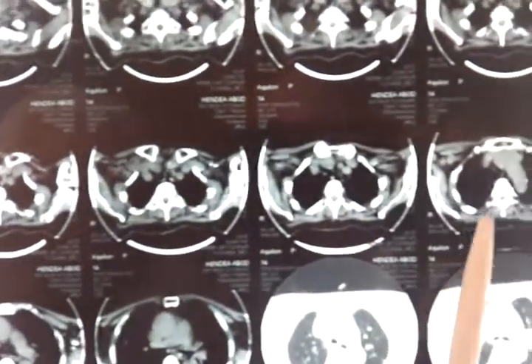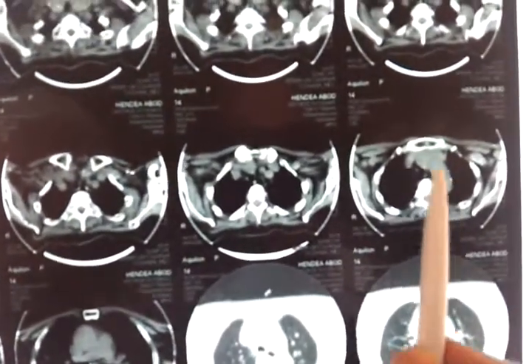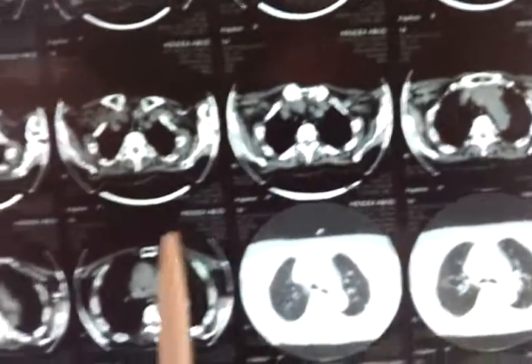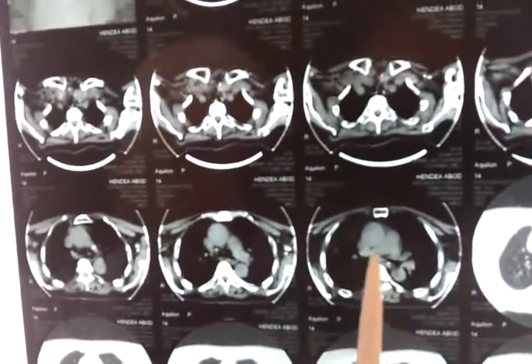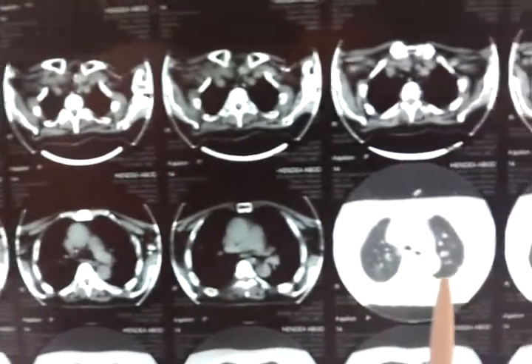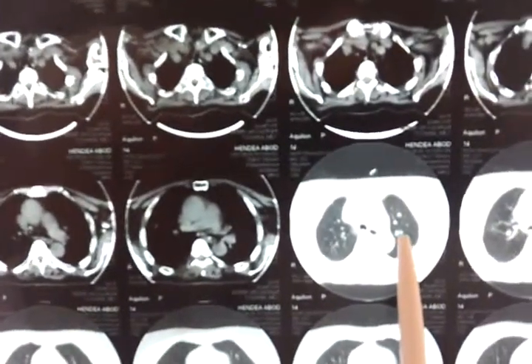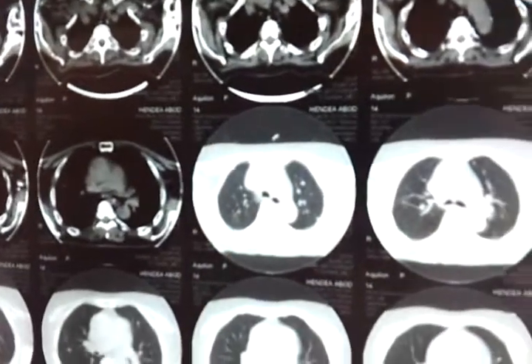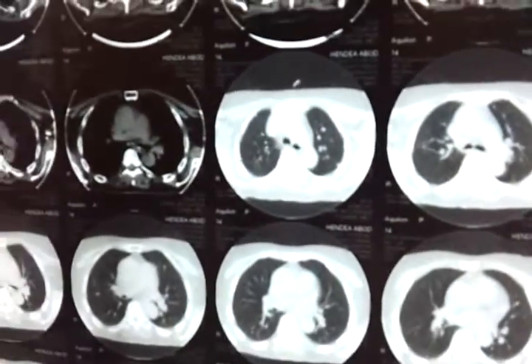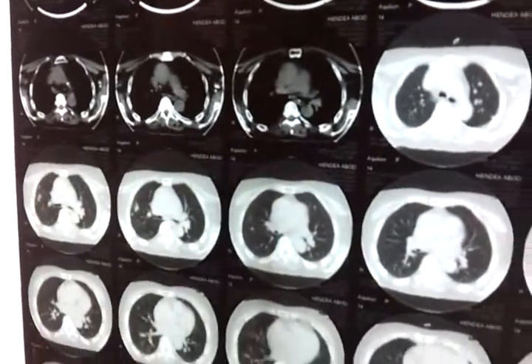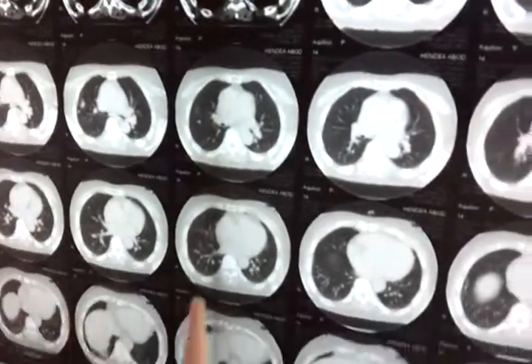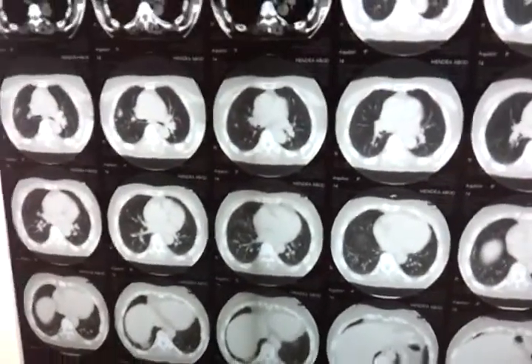If you set the density to zero you get the tissue window. If you decrease the density by more than 20 or 25, you omit the lung soft tissue and get a high-density lesion highlighted on the CT. We can see the trachea and two enlarged calcified thyroid lobes — an enlarged nodular thyroid. This is the trachea deviated, and this is the arch of the aorta and the pulmonary artery.